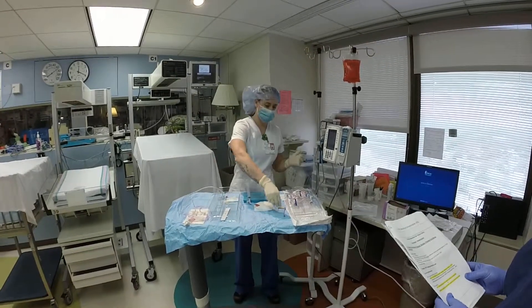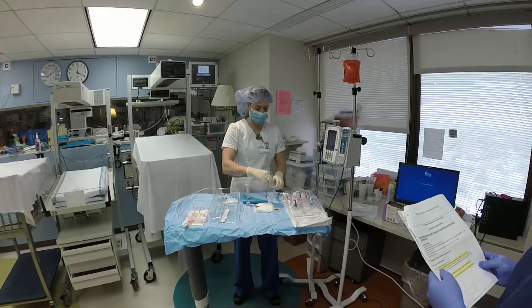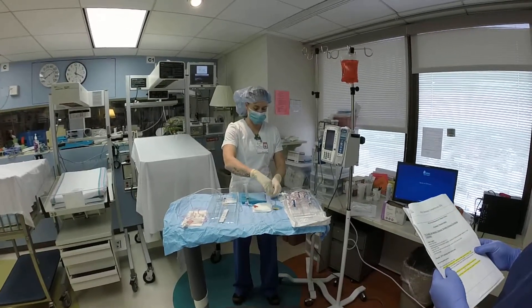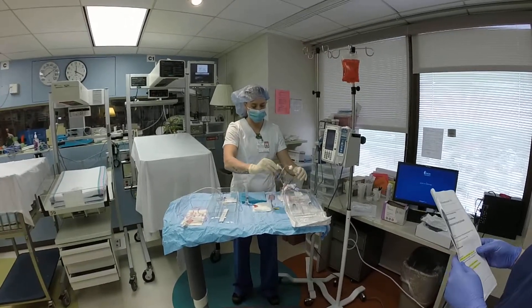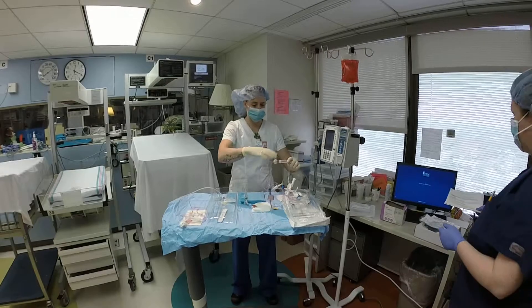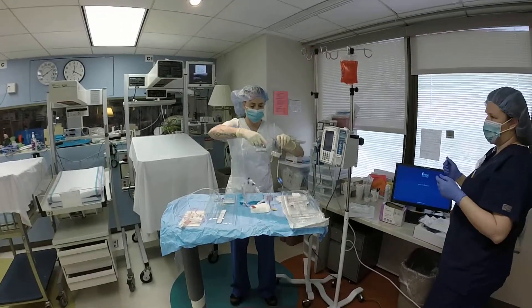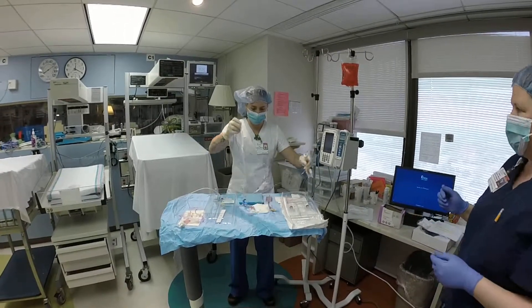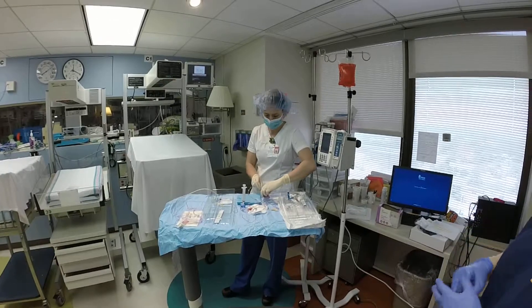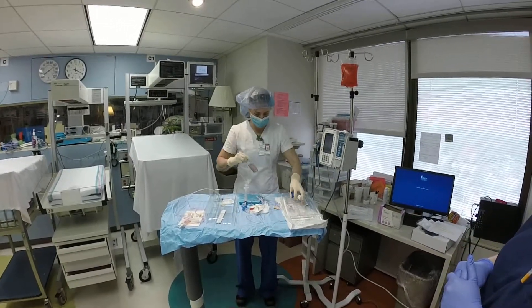When connecting up your UVC, you'll want to connect your blood to your SmartSight and your warming cartridge. It'll come with two different sides — your blood side, and you can clamp one off. That's your extension tube.